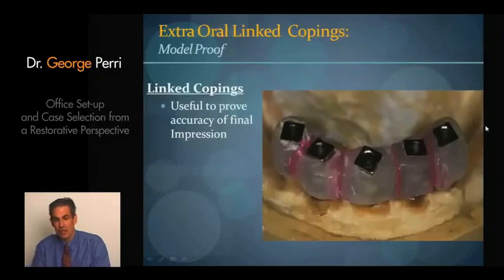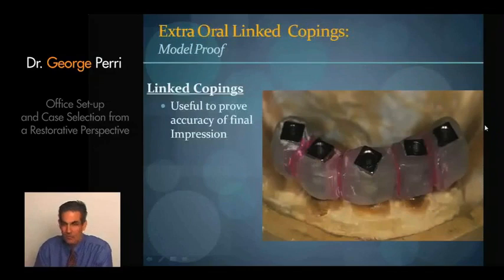Okay, now another variation to that technique, and let's just be honest, there's times we're not perfect. We don't have open tray copings ordered. We didn't have time to make linked copings. Patient comes in and all we have in the office are closed tray impression copings, and we want to take a final impression. We decided to give it a shot.